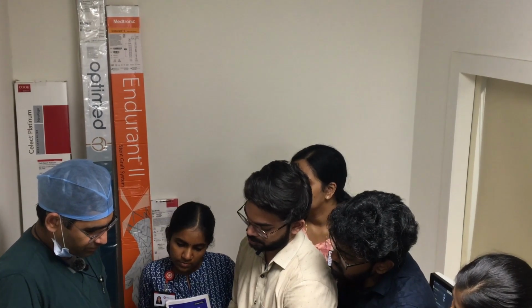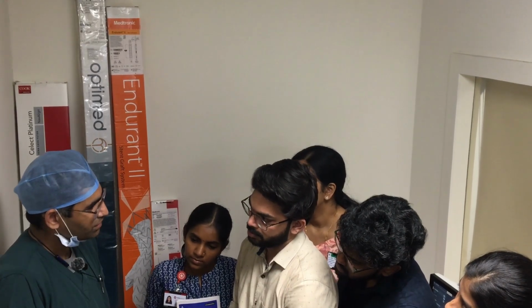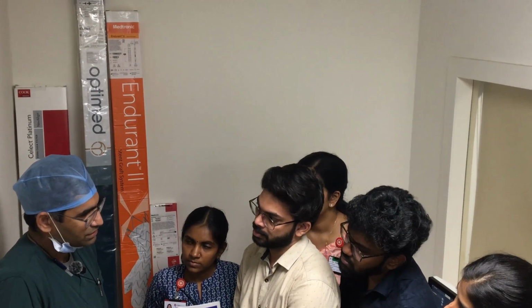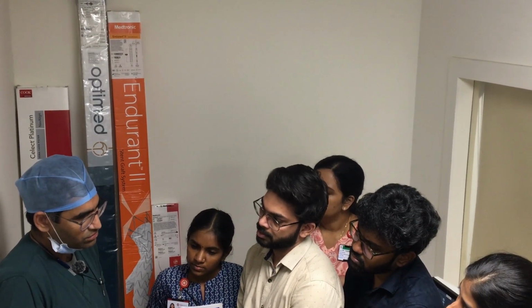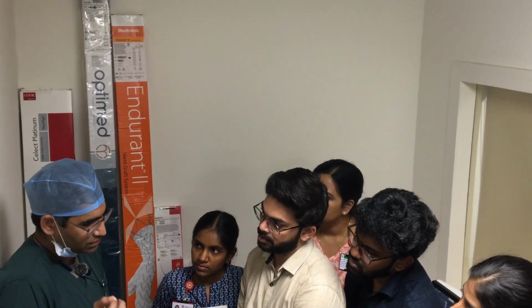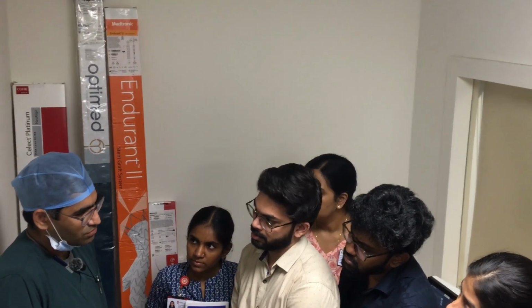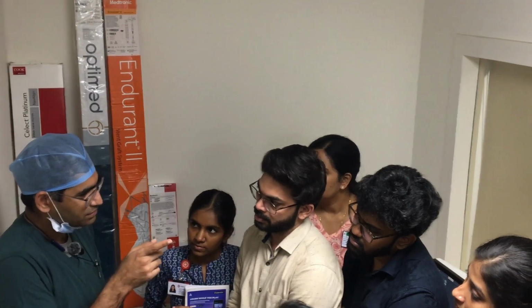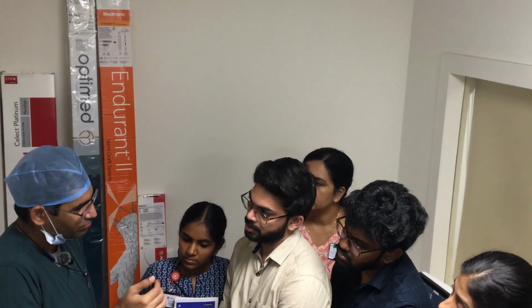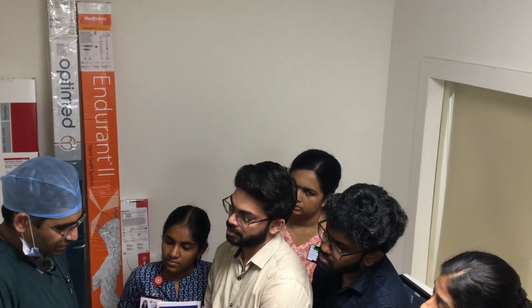This is a kind of CTO wire, for when you have a very tough occlusion, fibrotic occlusion, or even calcified occlusion. The regular wires may not go because they are not hard enough. How you define a wire's hardness is when you push. We are working close to 200 centimeters away from the target area. So when we push outside, how much the tip moves forward, or if the lesion is too tight and the tip is soft, the tip will buckle. So we need something which is harder than the lesion. That's where these CTO wires come in.